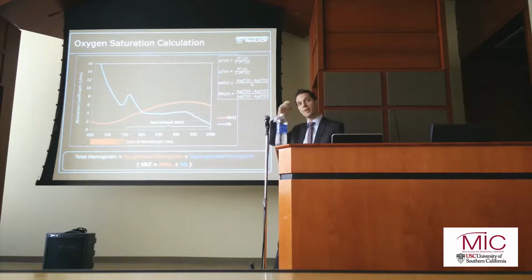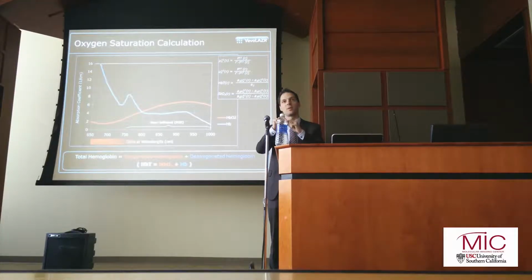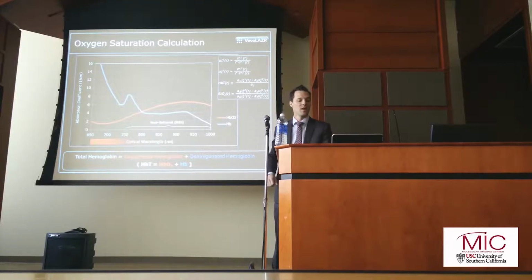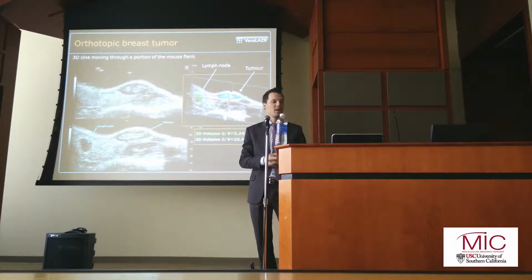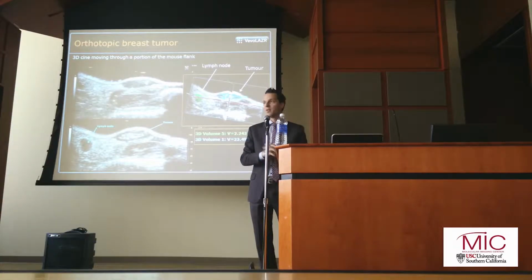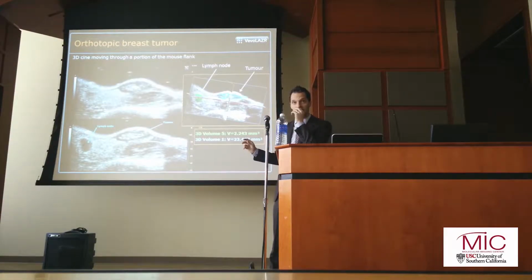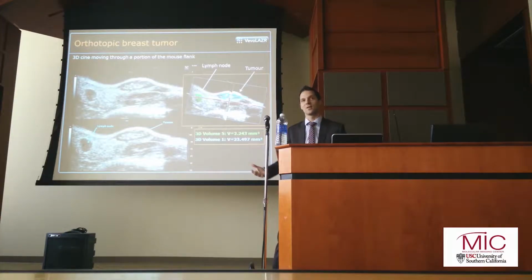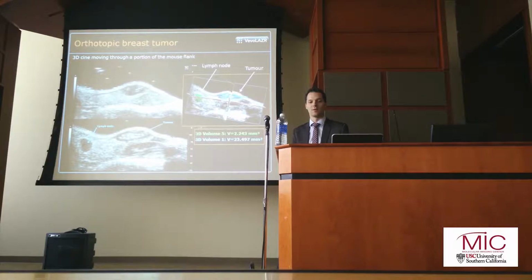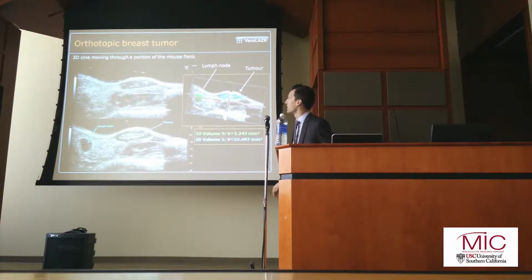Not only can we do these measurements, I mean, you can do this with a pulse ox, those things you clip on at the hospital, you clip it onto your thumb, you get an SO2 reading. But we're able to do this with very, very high resolution, and again, completely non-invasively. And I want to give an example of this in a second, but I kind of want to give more of a case study here to demonstrate the use of these kind of measurements.